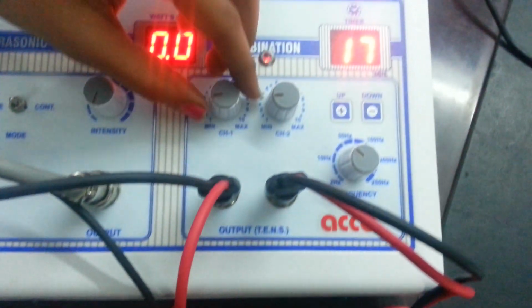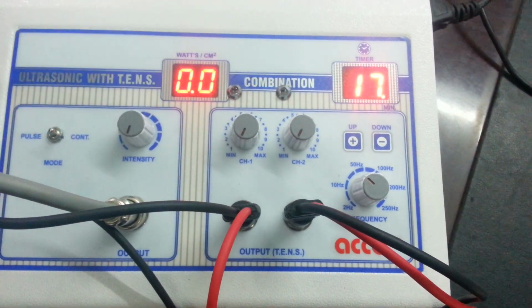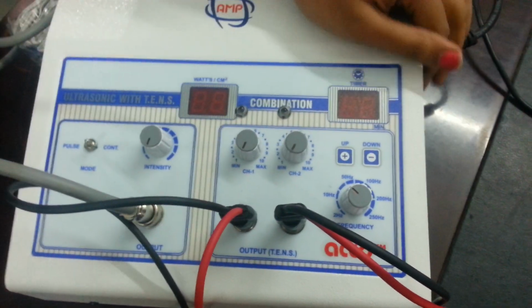After treatment is completed, make all the intensity knobs at 0. Switch off the machine. Demo is completed.